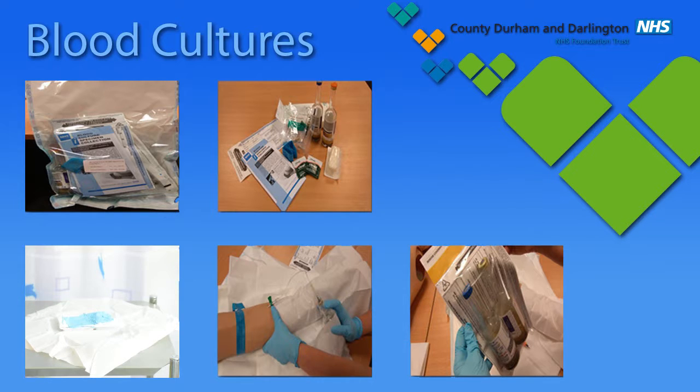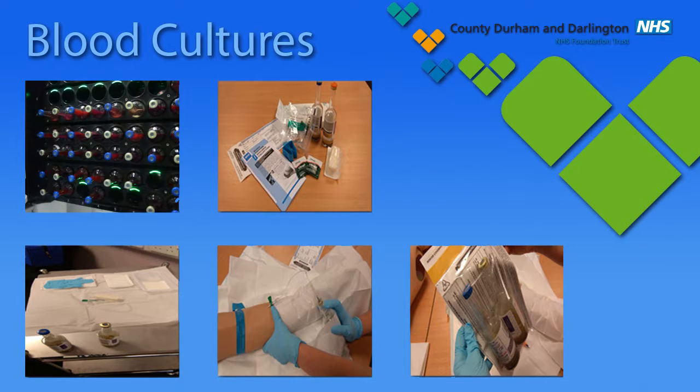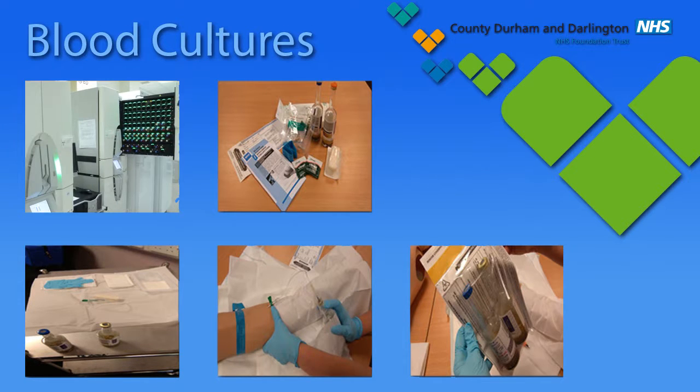Blood cultures are an important investigation in the diagnosis of the septic patient. They are invasive and should be performed using a careful and aseptic technique. Failure to follow the correct technique will lead to contamination of blood culture bottles with skin bacteria. Contaminated blood cultures are wasteful of resources, difficult to interpret, and may lead to unnecessary antibiotic treatment for the patient.